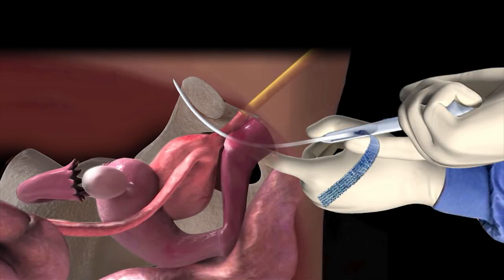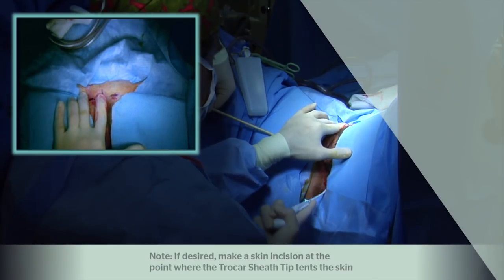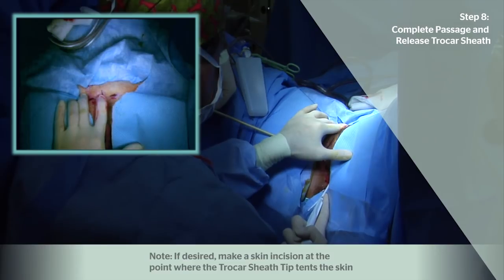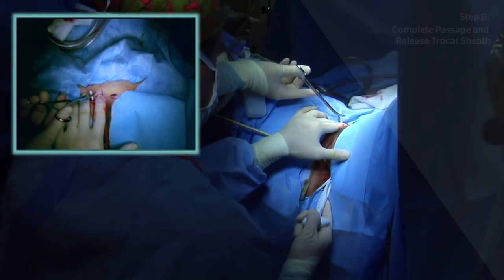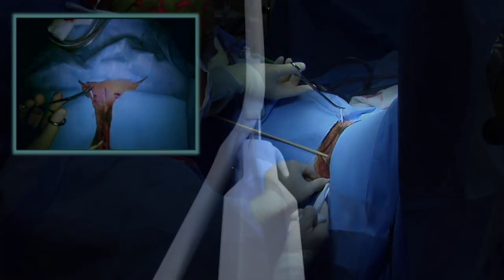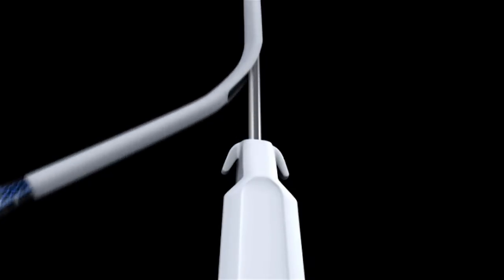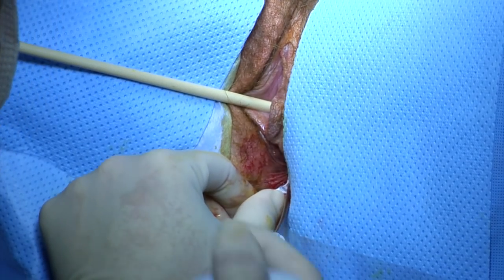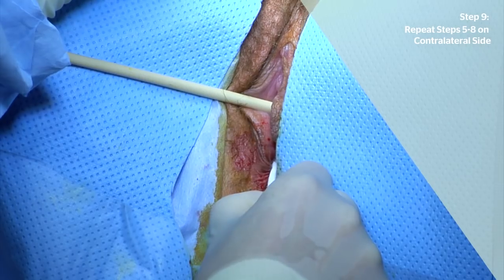Push the trocar sheath tip through the rectus muscle and the skin. If desired, make a skin incision at the point where it tents the skin. Grasp the exposed trocar sheath tip and pull gently upwards. Remove the trocar sheath by pushing it laterally off the trocar sheath lock. Carefully withdraw the trocar shaft from within the trocar sheath. Repeat the technique on the patient's other side.